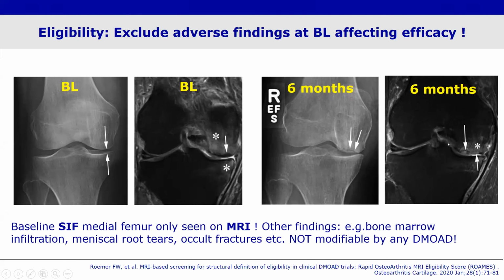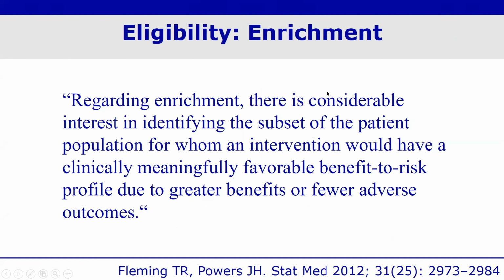There are other findings that are not visualized by X-ray that you may not want to include at baseline. These may include meniscal root tears, bone marrow infiltration, and so on. And these findings are not modifiable by a DMOAD.